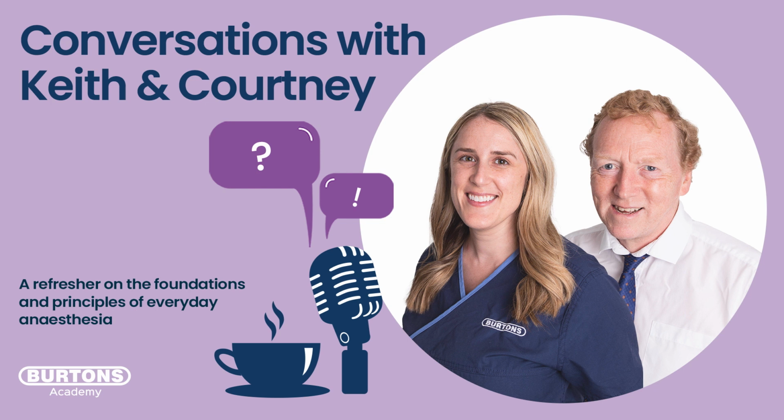Okay, one thing I did say at the beginning, maybe just catch up on: I did talk about IE ratio, and I haven't covered that. Just very briefly cover IE ratio. We talked about inspiratory and expiratory time. The way that we ventilate with positive pressure causes this problem of reduced cardiac output during inspiration, and the recovery time is during expiration. So you'll see a lot of textbooks say do not allow an inspiration-expiration ratio of less than 1 to 2.